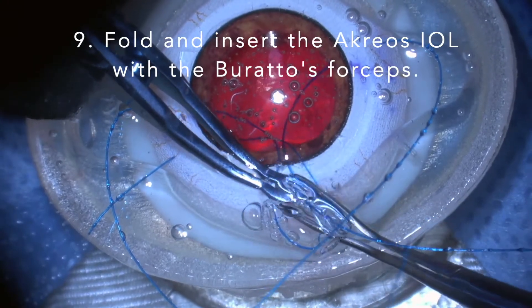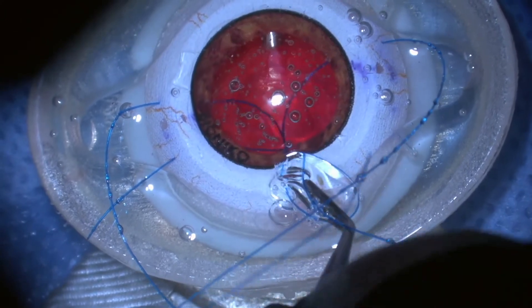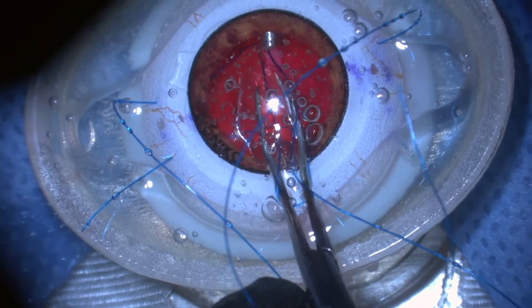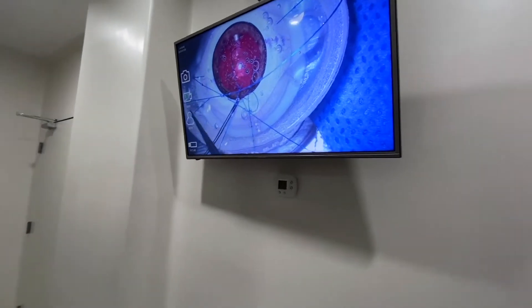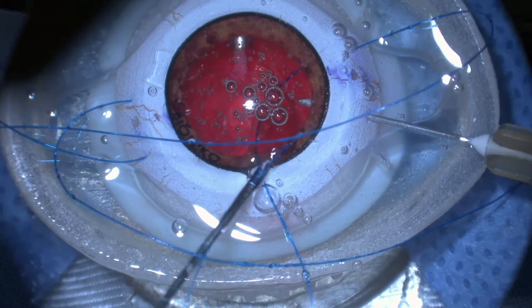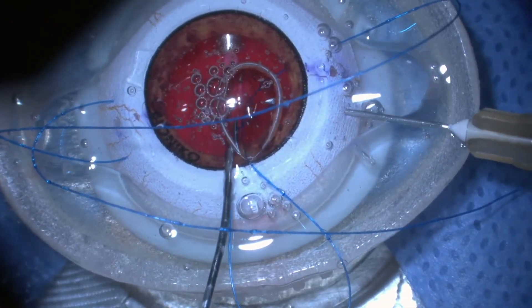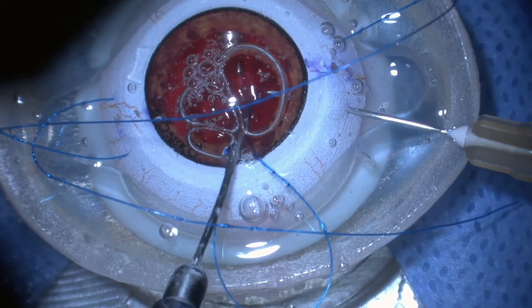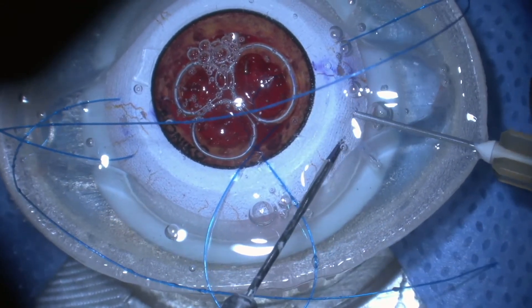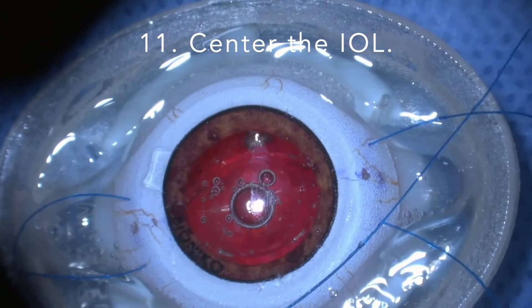Fold and insert the IOL with the Burratus forceps. Make the final sclerotomy and insert the proline. Center the IOL.